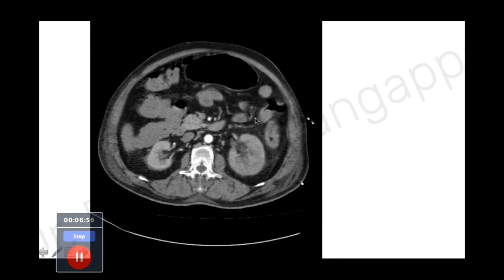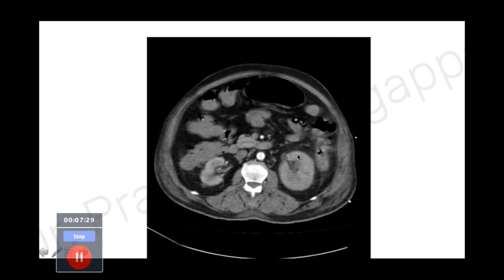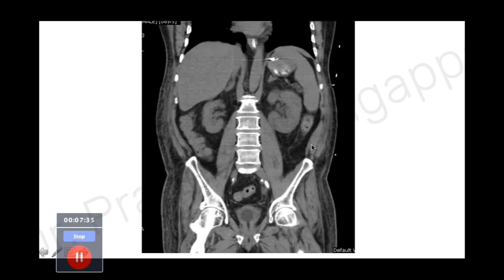This next patient came with septic shock and symptoms of a urinary tract infection, so a CT abdomen was done. You can see pyelonephritis: the left-sided kidney is notably larger than the right. This is acute pyelonephritis. The patient underwent drainage to remove the pus. The corticomedullary differentiation is obliterated and the huge left kidney is clearly appreciable on the scan.